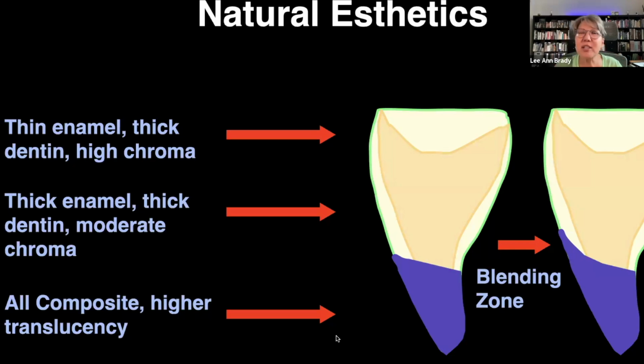And then when I'm actually placing that last layer of composite on the labial, I don't worry about stopping the composite right where I think my bevel ends or my blending zone ends. I actually take my plastic instrument and I move that composite way out over the labial of the tooth, thinning it as I'm getting further and further from the prep. And then I know I'm going to thin that back to that literally hundredths of a millimeter, that infinity margin.